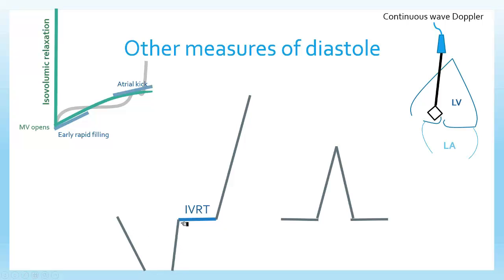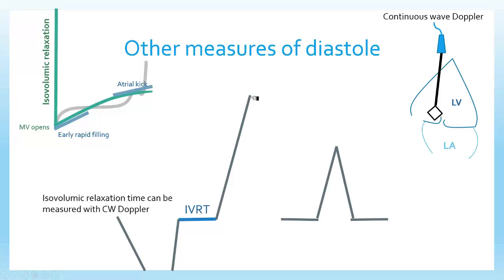If I throw a continuous wave Doppler just off to the side of the mitral valve, I'll pick up both signals: systolic flow away from the probe, and inflow velocities toward the probe. The first measure of interest is isovolumic relaxation time (IVRT). I can measure that with continuous wave Doppler — it's the space between when the LVOT signal ends and when transmitral valve blood flow starts. With early diastolic dysfunction, IVRT gets longer because the ventricle takes longer to open. However, when left atrial pressure gets really high, IVRT will ultimately shorten, because the high left atrial pressure pops the mitral valve open early.